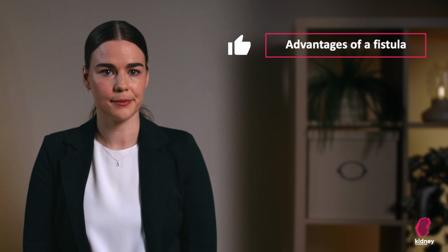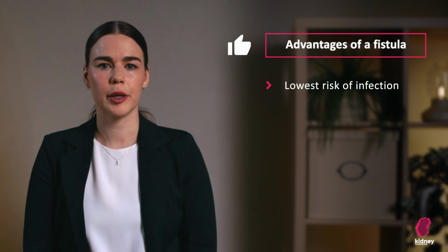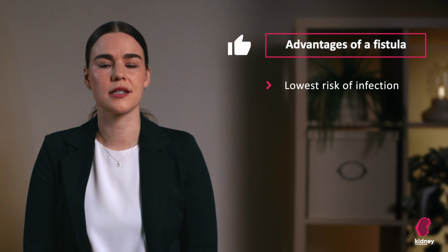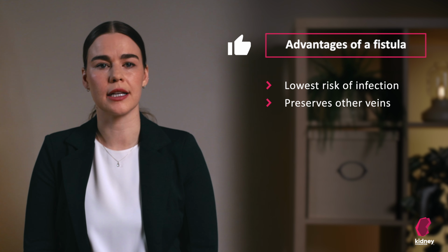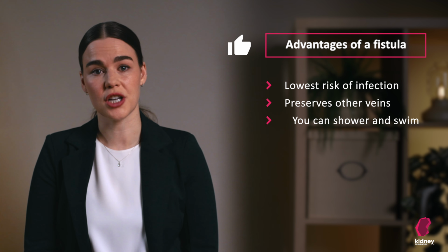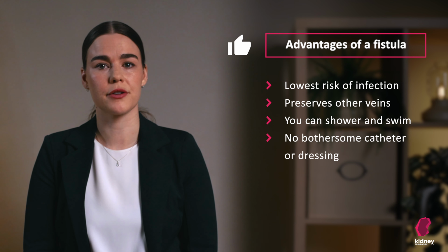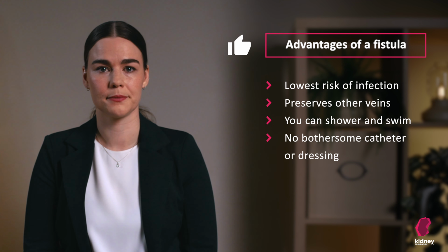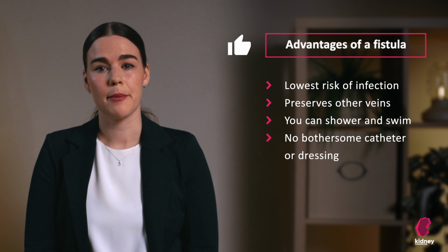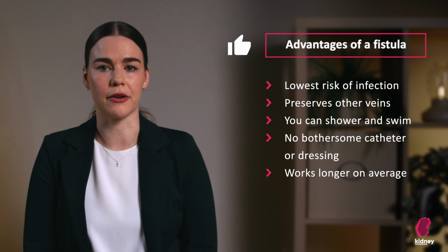Advantages of a fistula. Fistulas have the lowest risk of infection and are very rarely the cause of severe infections such as blood infections. A fistula preserves your other veins in case you need another type of access in the future. You can shower and swim with a fistula. You do not have any bothersome catheter or a dressing. It is generally the type of access that has the best longevity, meaning that it works for the longest amount of time.